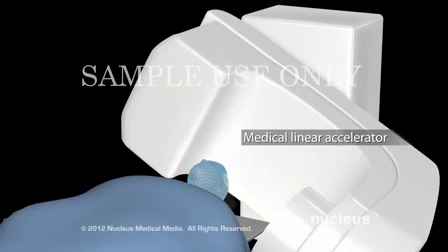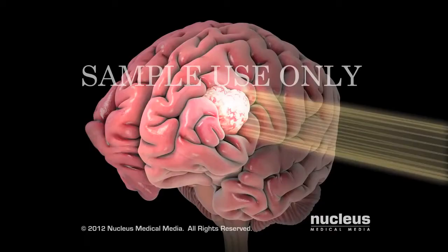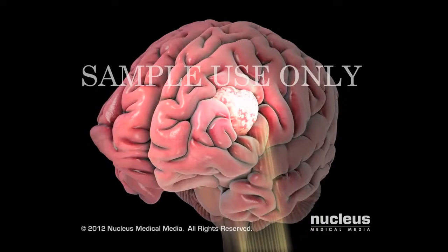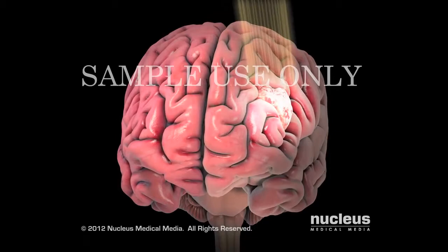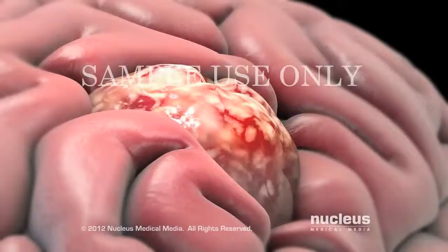During your procedure, a medical linear accelerator will deliver an X-ray beam to your tumor. A computer inside the accelerator will adjust the beam with a device called a collimator. The collimator will adjust or modulate the intensity, direction, and shape of the radiation beam, allowing higher doses of radiation to be delivered to your tumor while sparing your healthy tissue around it.